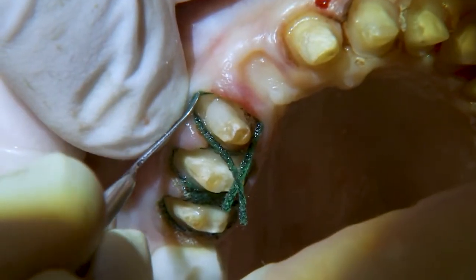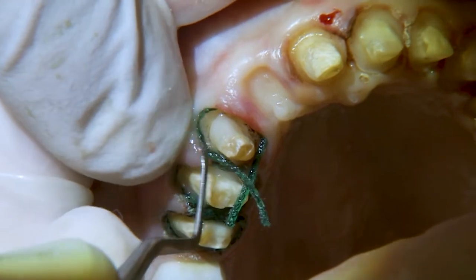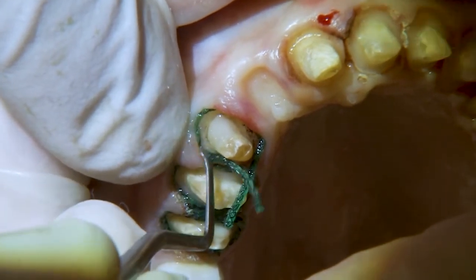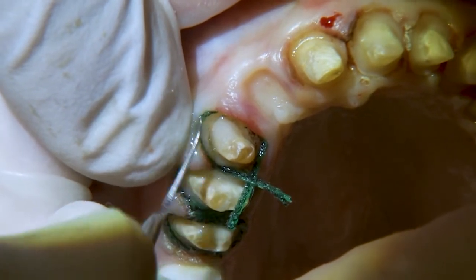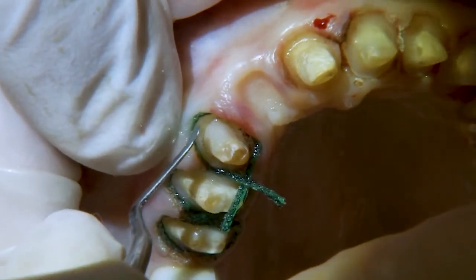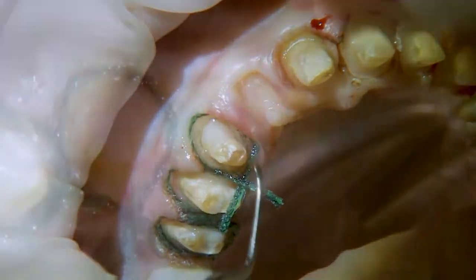But I can tell you that there's lots of cords out there on the market and lots of hemostasis materials. I happen to like ultra dense cord. This is the Ultra Pack. I like to use the Ultra Packing instrument, so I can just roll that cord right into the sulcus. And there's all different sizes, but I can say that we like to do the double cord.